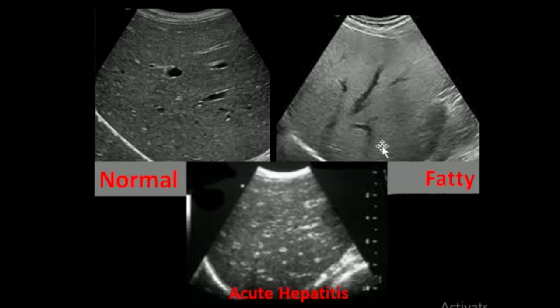The liver is normally homogeneously echogenic. If fat is deposited, it becomes more echogenic. In acute hepatitis, overall echogenicity is reduced due to inflammation and swelling or accumulation of fluid, so the portal vein borders stand out more brightly.